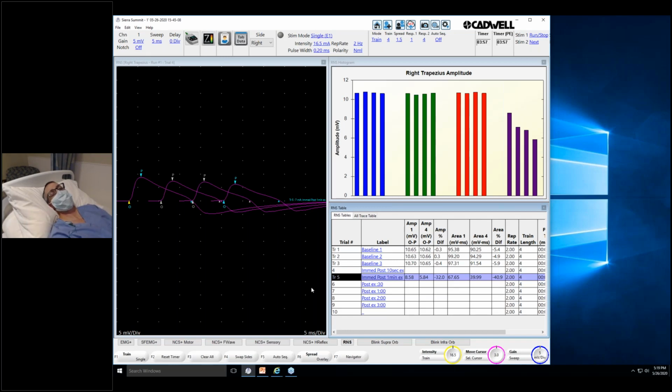Yeah, I think it's the same issue as the bar electrode. I think it's probably worse with sticker electrodes, because they're moving around, they're sliding, the skin's sliding, the muscle's moving, and I think there's more of a risk of not stimulating the nerve.